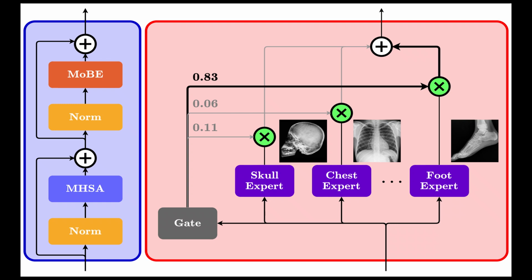When you train a single neural network on widely different body parts, the features start fighting each other. A wrist looks nothing like a chest. The model's internal representations get pulled in conflicting directions. What's useful for understanding a fracture in a wrist actually interferes with what's useful for detecting a heart condition. This is called feature interference, or more formally, negative transfer from multitask learning. The minority body parts just get drowned out.